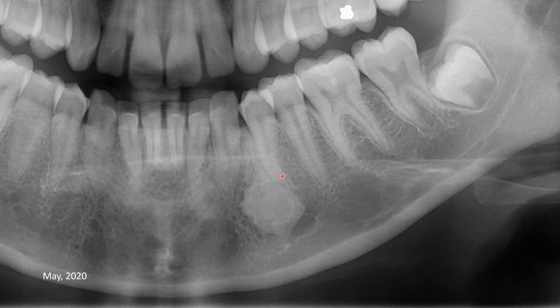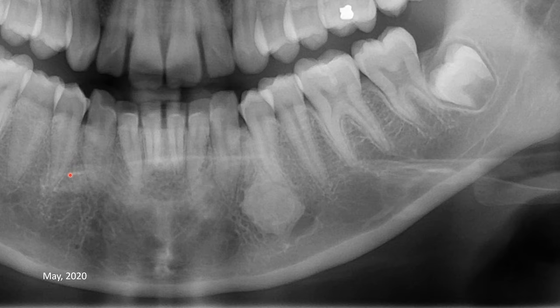The margin is still well defined. This is the mental foramen and it does not appear to be compressed. The root of the premolar may be slightly distally displaced — compare this with the premolar on the other side. We have a few older panoramic radiographs; let's review those.